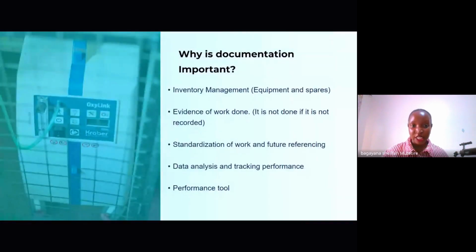So it's really important that we maintain our documents so that we are able to manage our inventory. So why documentation is really key and priority for us. One is for inventory management. So we have quite a number of equipment all over the southwestern region. So it's important for us to know what's at office, what are the different facilities, what equipment is at the facility, what has failed, what's working, the spares we need, evidence of work done.